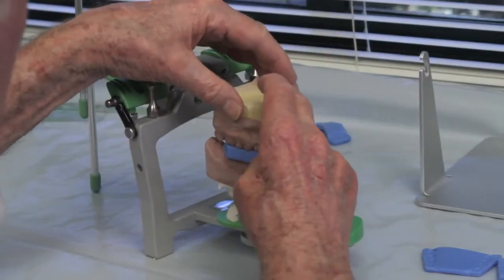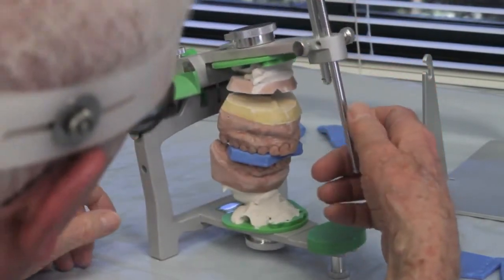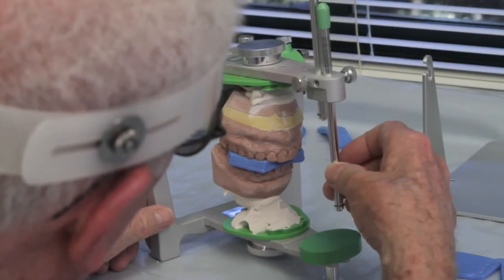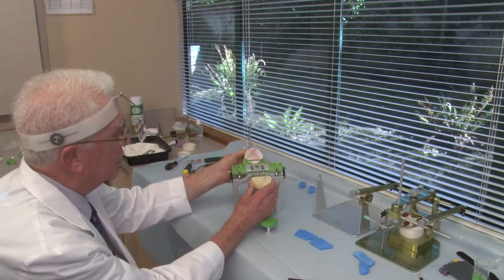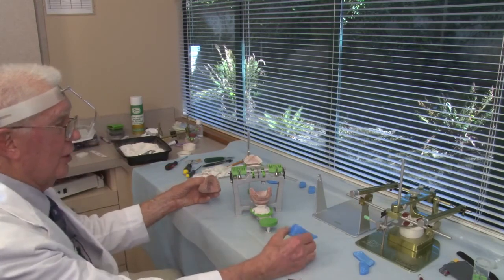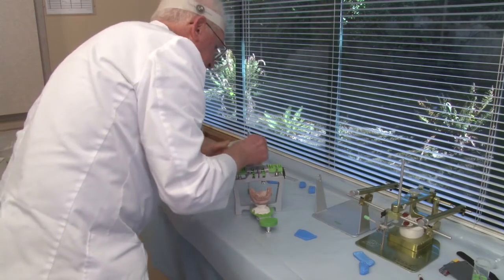Make sure it's seated good. Now very slowly close. Watch and feel. So the thick one checks. That is, I captured the position of the mandible in a fairly open position. Now I use the two thicknesses of wax. The mandible is closing a little more now.